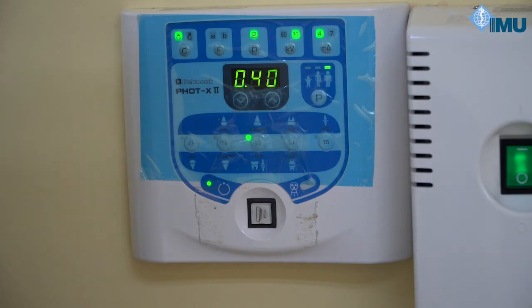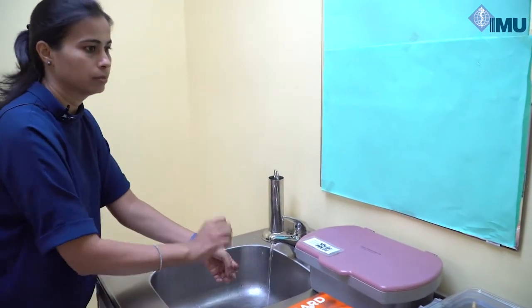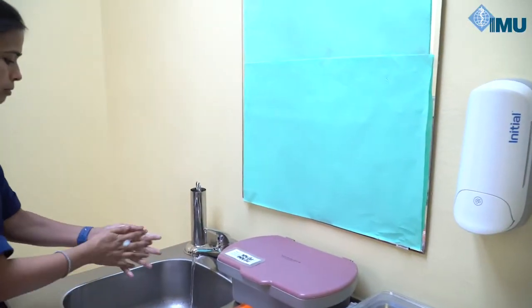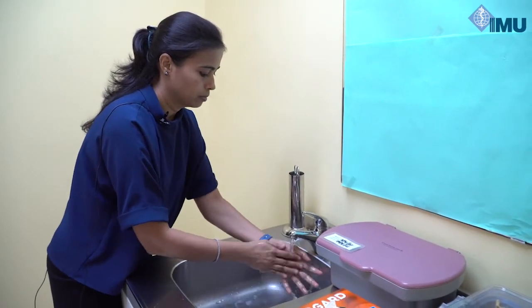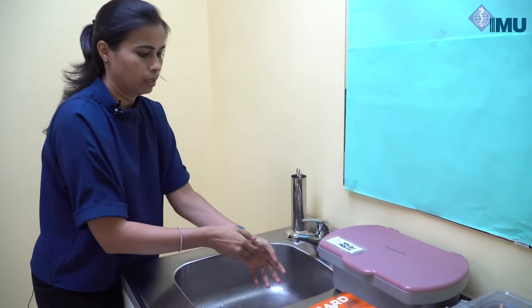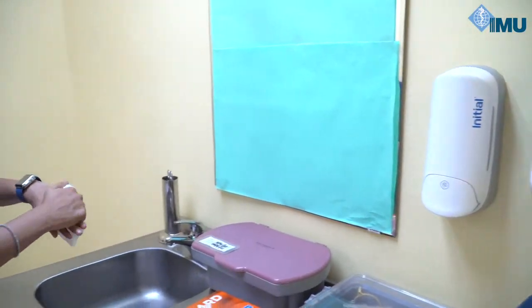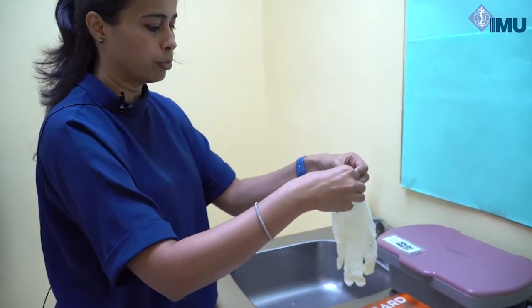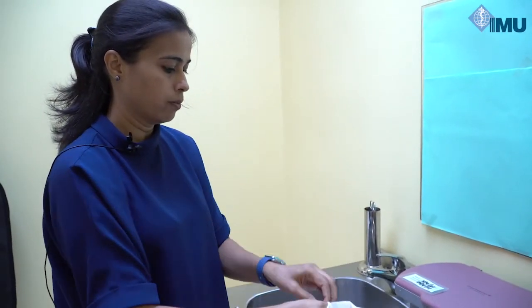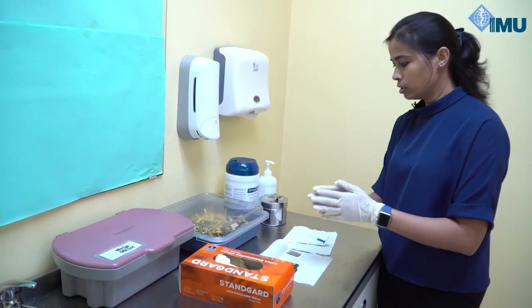Once you set all the parameters and exposure time, proceed to selecting the film holder and film. As part of infection control measures, make sure you wash your hands first with soap and water and dry with a paper napkin, then wear the appropriate-sized gloves.